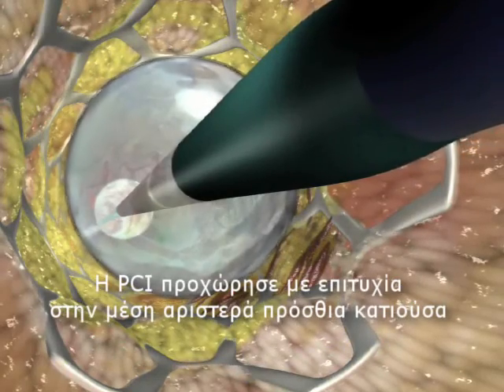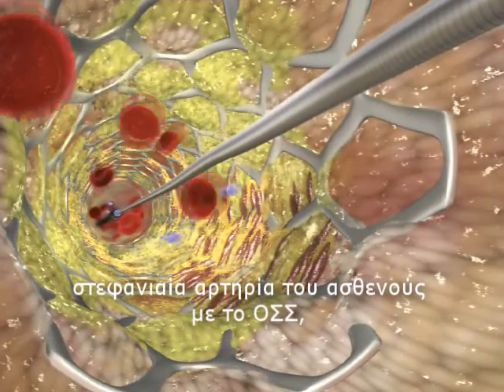PCI was successfully completed in the mid-LAD of this ACS patient.